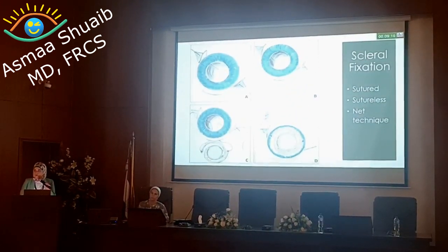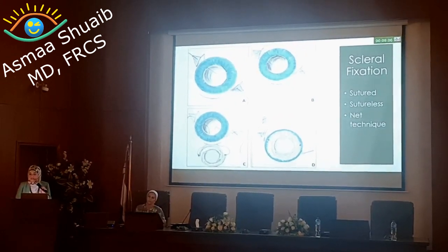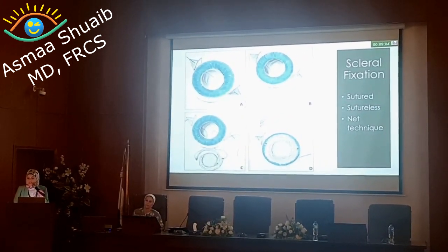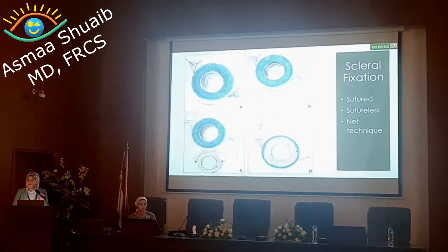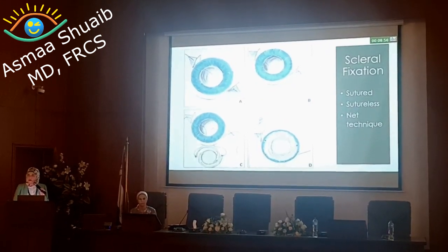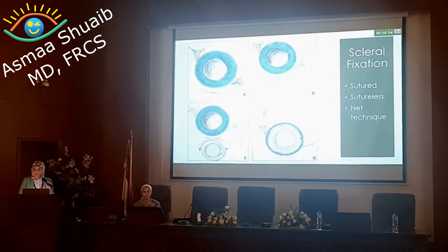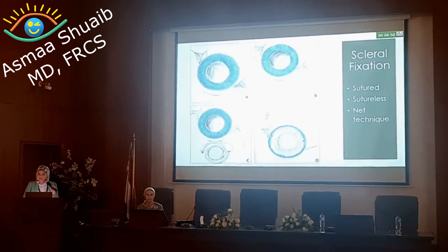Moving to the next option, we have the sclerofixation IOLs, either sutureless or sutured. We have lots of techniques, like the Hoffman pocket and other full flange techniques.